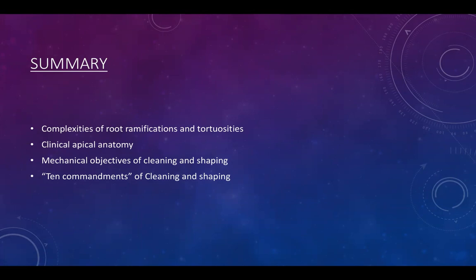If you see that it goes more distal, and you do have room for that in that angle x-ray, that tells us there is another canal. Also, CBCT nowadays gives us information about that. And clinically, when we're doing an access opening, we usually go for the largest canal first. Once you get that, then you start removing more of the roof to look for the more difficult ones. If you see on the floor of the pulp chamber one large distal canal in the lower molars, try to look at the dark lines that we see on the floor, and see if they go straight into what would be the mesial.